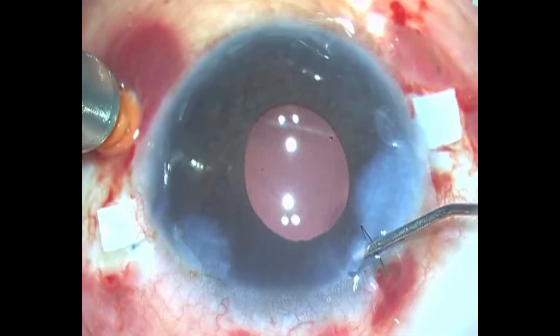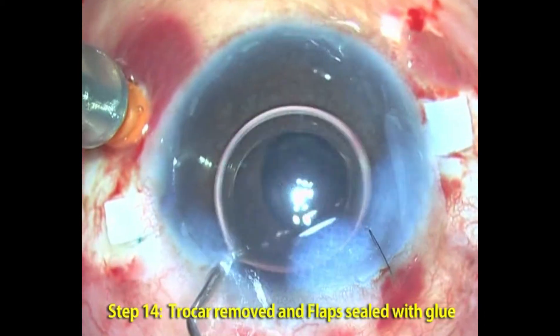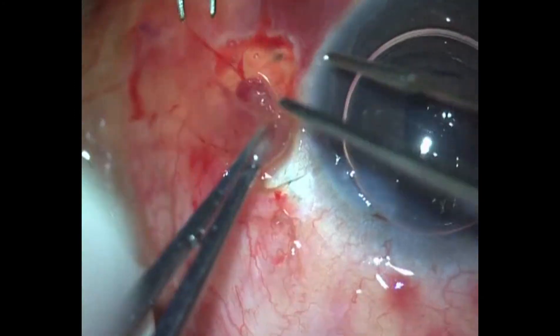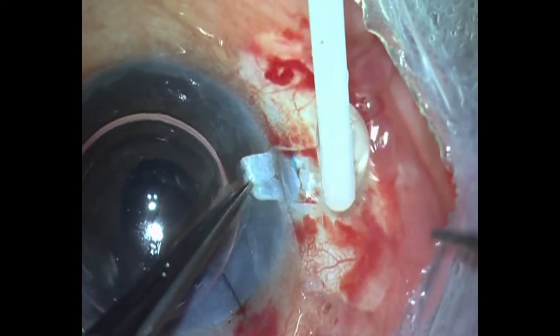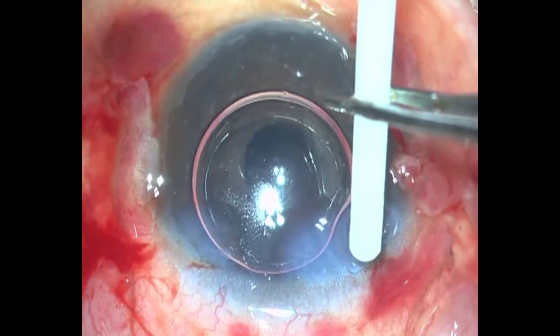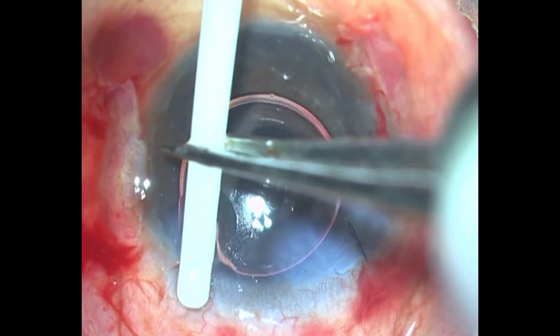The main port is stromal hydrated, and a suture can also be placed there. The infusion cannula is removed. Using the fibrinogen-thrombin combination — we call it fibrin glue — we glue not only the scleral flaps but also the conjunctiva and the ports, including the main port and the side port.